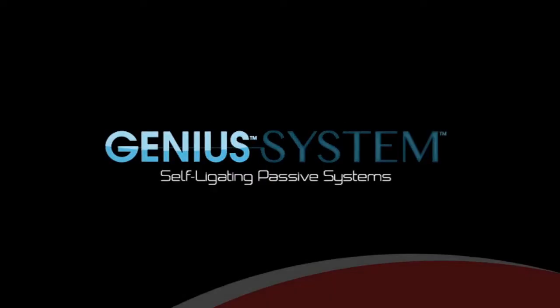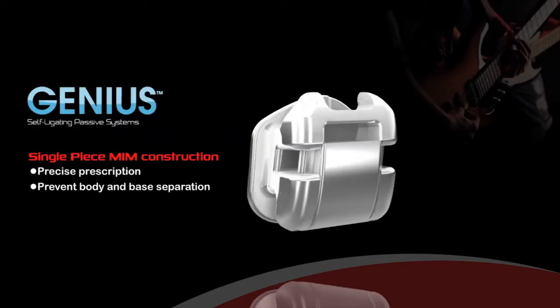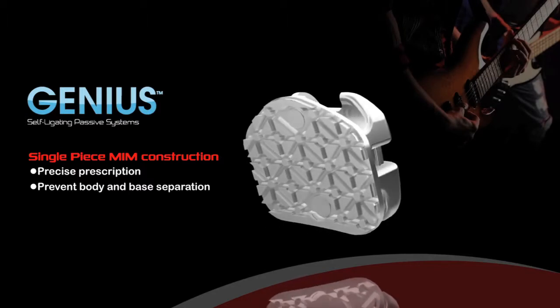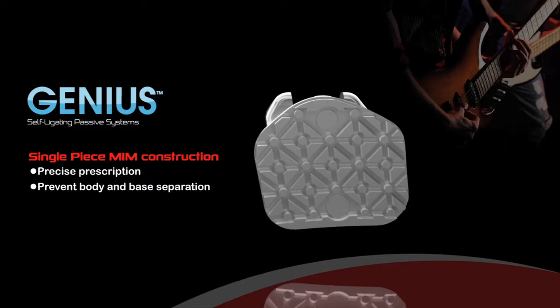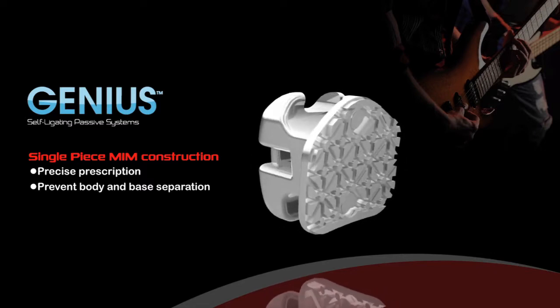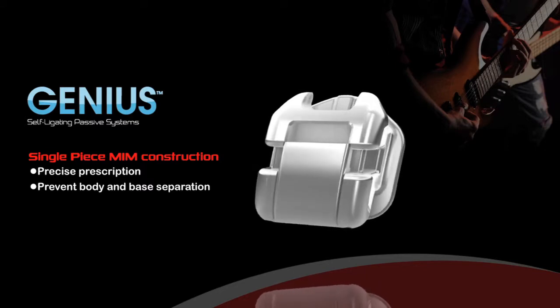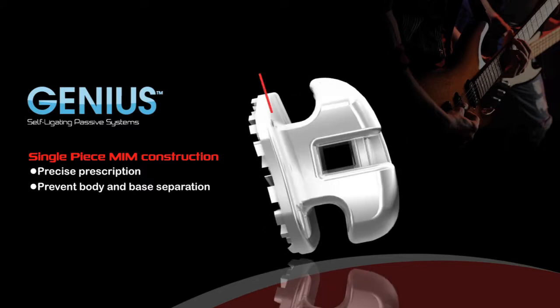Introducing the Genius Self-Ligating System from OrthoPartner. Genius is a passive self-ligating bracket that combines strength and precision into a single-piece MIM construction. The smooth surface of the bracket design helps with oral hygiene, which can prevent tartar and plaque build-up during the lifetime of the treatment.